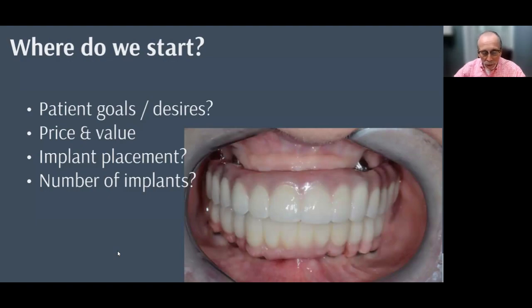And I can remember as a lab guy thinking, "Oh, that's easy. I'll just put some more stuff up there, right? And we'll stop that." And immediately when you say it, you realize no, I can't do that, because if we add more stuff up there, she won't be able to clean it, which is also a very big requirement here, that we keep it clean under there. So it was a challenge, right? It was a simple thing of, what do we got to do? And so this was a case that really needed more of a flange. But we can't do that with a fixed restoration, right?